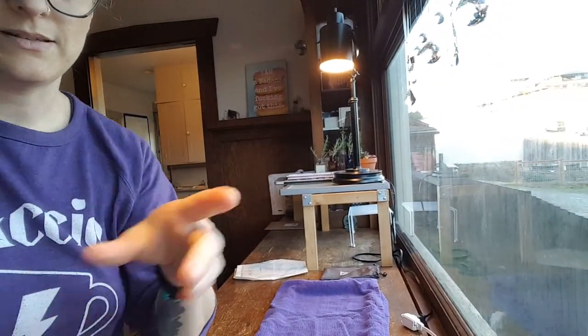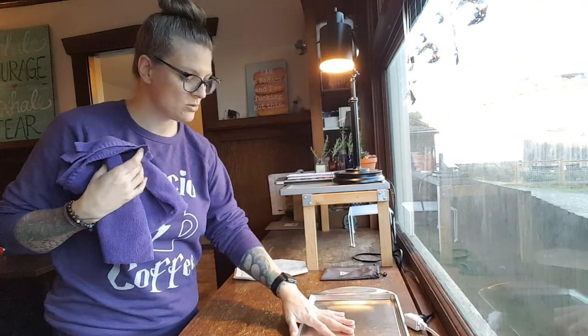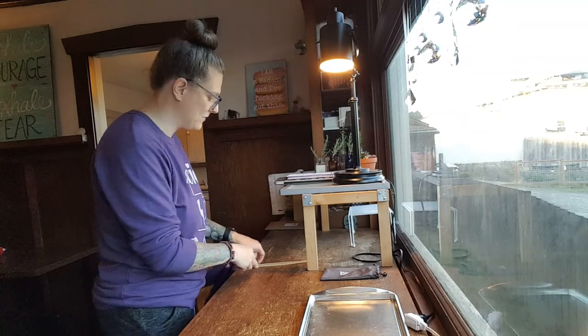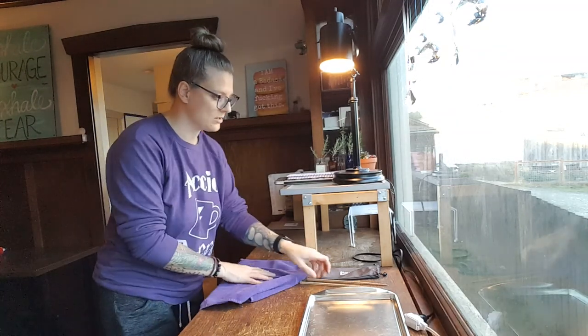So this probably wouldn't be exactly where I would work. I would probably be on the counter in the kitchen, but since I can't really do that, I'm just going to do it here. So this is what I'm going to put the instruments on — sterile gloves and chopsticks. I'll show you why and hopefully it works.